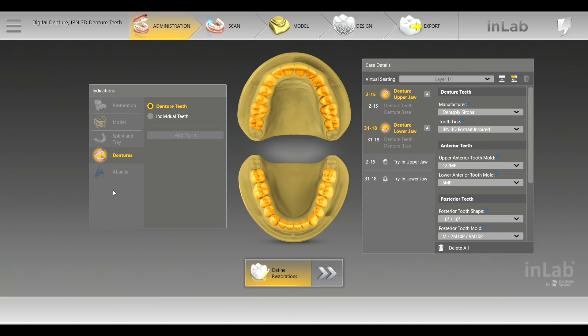We're going to dig a little deeper into the software and show you some of the techniques that I have. This is not going to be a very long video — we'll have more in-depth videos coming out. This is just to get you by, for people who might not have been able to see it in Chicago. I'll just give you a little refresher on it.